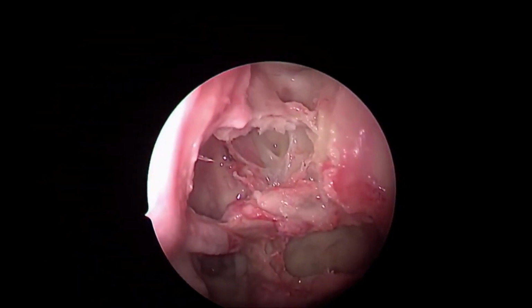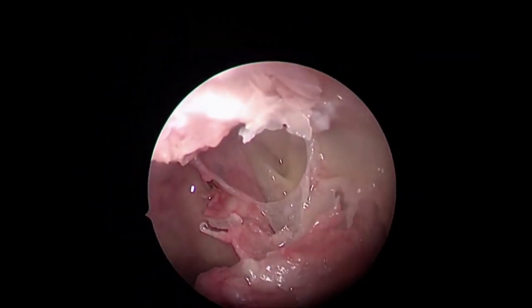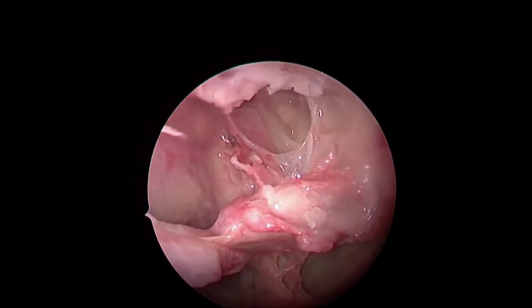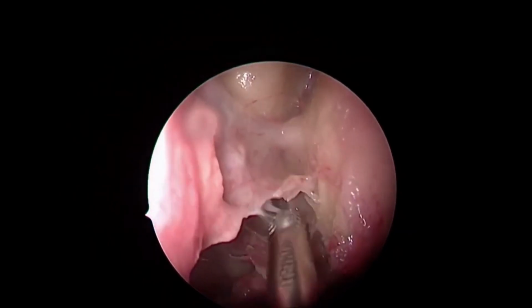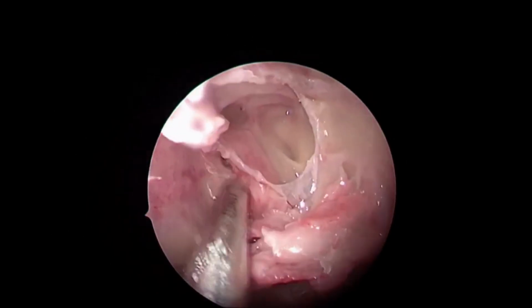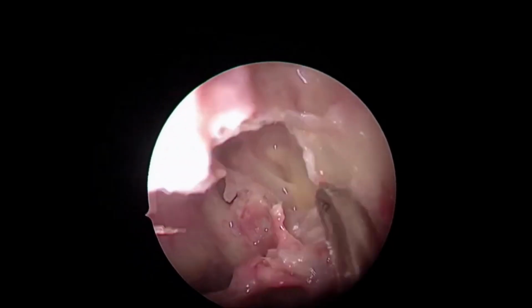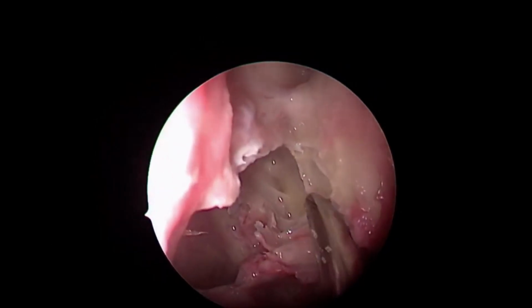See this? The lateral limit is lamina. See here? The medial limit is superior turbinate. And my posterior limit for the post-ethmoidectomy would be the sphenoid sinus. So as long as I stay anterior to the sphenoid, I have no issues, no fear in dissecting the post-ethmoids at all.